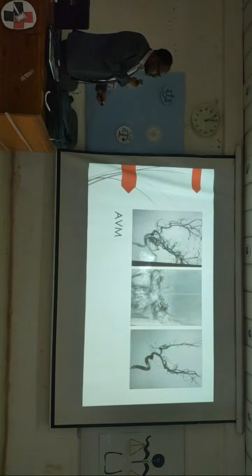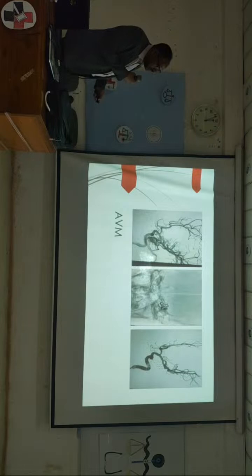This is the lesion here, with arterial feeders from the middle cerebral arteries, and this is the draining vein. And our target is to go inside this lesion and to embolize the connection between, not to close the artery and not to close the vein, just to close the dysplastic vascular area. Here we go smoothly with the microcatheter to deliver embolizing material slowly till you obtain complete occlusion of the lesion. And here, this is the lesion, and this is after occlusion, total occlusion obtained in this case.